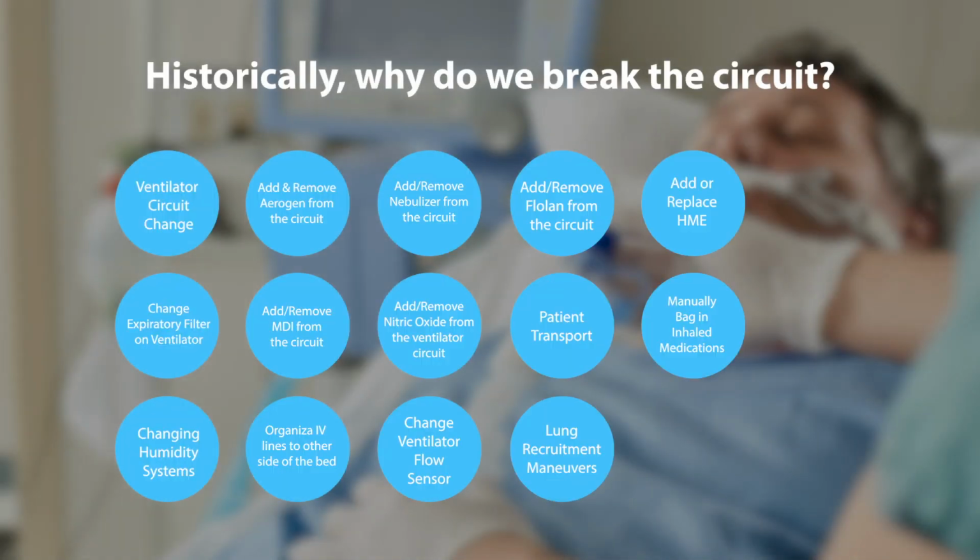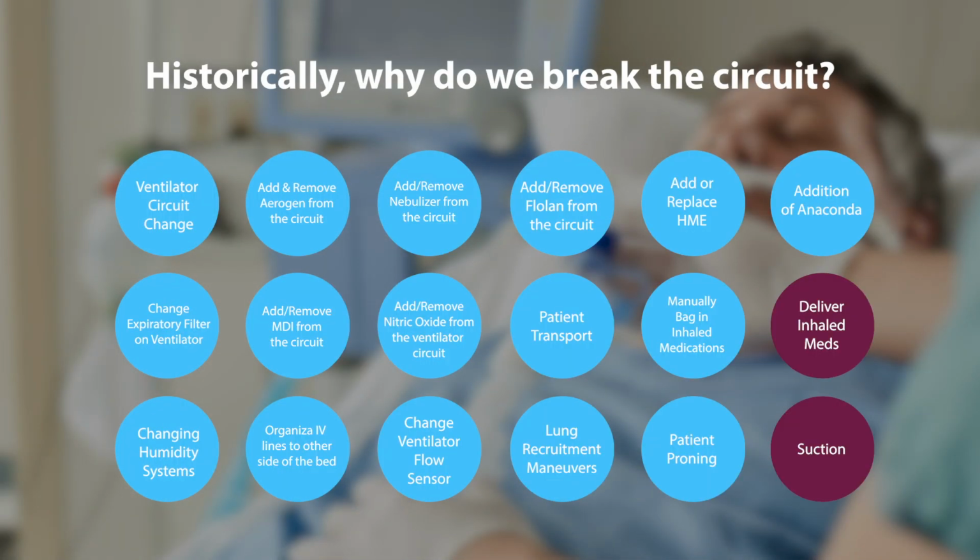These are some of the most common reasons a patient is disconnected from a mechanical ventilator. At present, there are only two solutions available to hospitals for maintaining a closed circuit. They are the delivery of inhaled medication and inline closed suction systems.